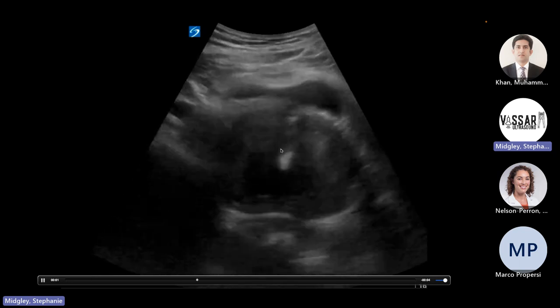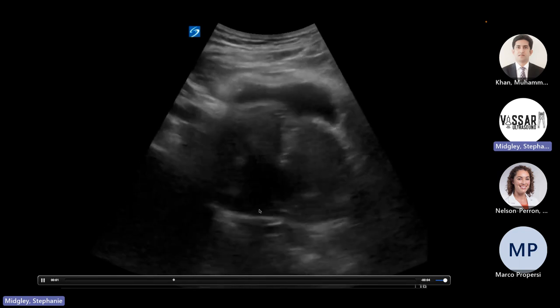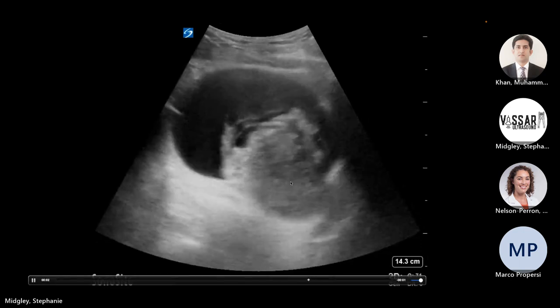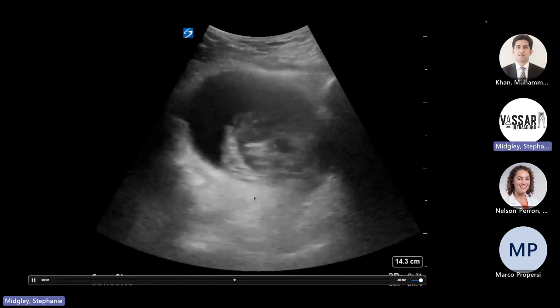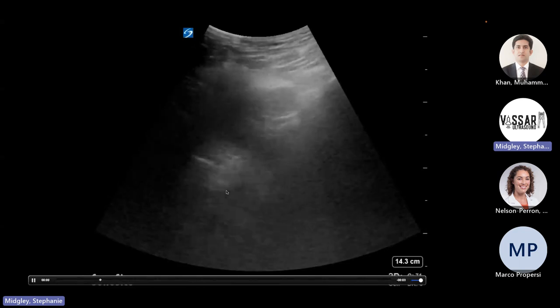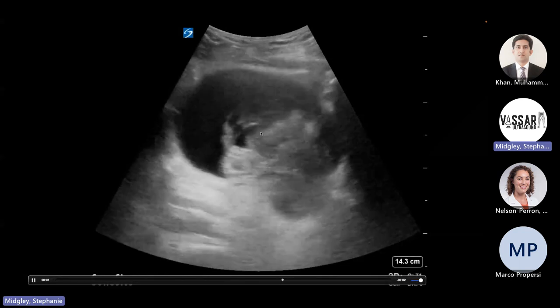You can also just assess if they have a giant prostate, right? This is a massive, massive prostate. You can just kind of eyeball it and say that is just not normal. Or you can find their bladder mass. So someone who's been having hematuria and say flank pain, and they're having some urinary retention, you can see that they have a big giant bladder mass.